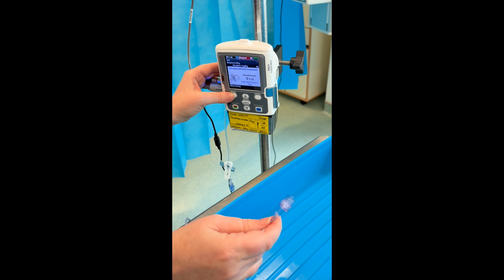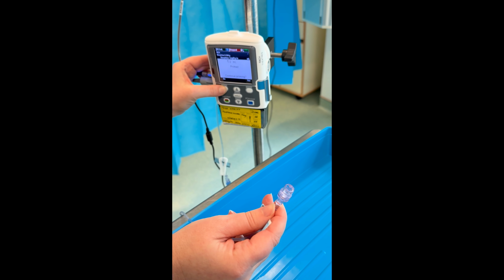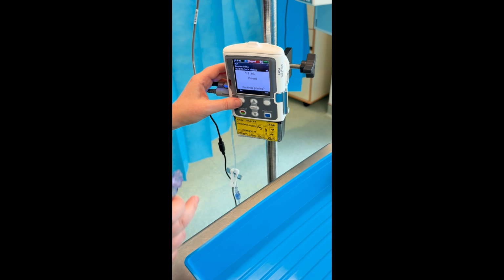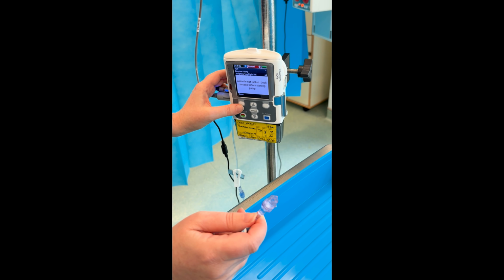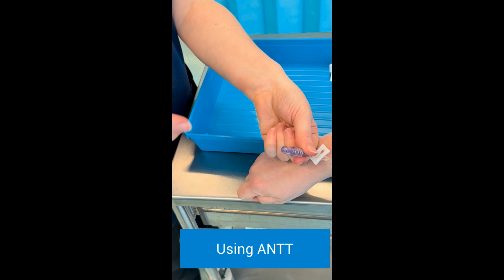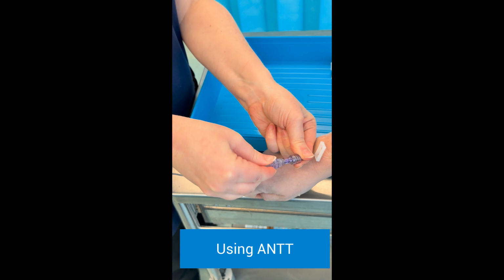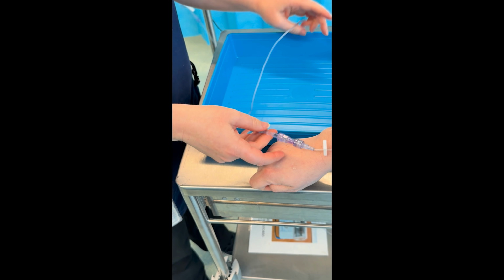When the solution gets to the end of the extension set, you must press stop priming. The pump will ask you whether you want to continue priming. In this case, we need to press no. Ensure your cannula is patent and then attach your giving set to the cannula and unclamp.